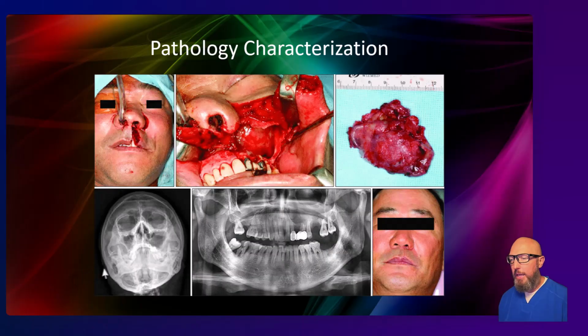And I would say keep in mind, when I'm suspecting pathology, I like to see the other side. So this is a case where I might default to a larger field of view than I would for some of these other things like implant planning. If it's a single impacted tooth, you can use a really small field of view.